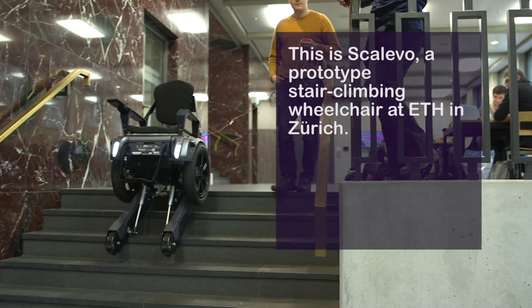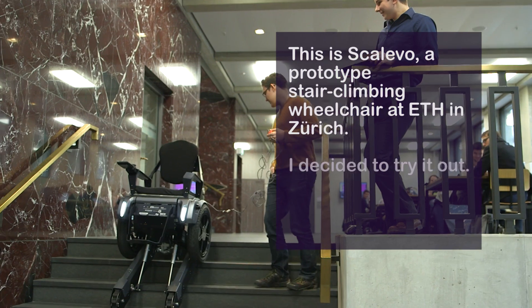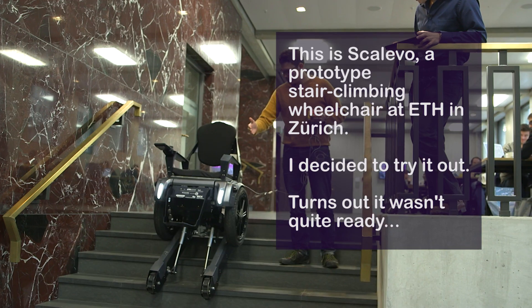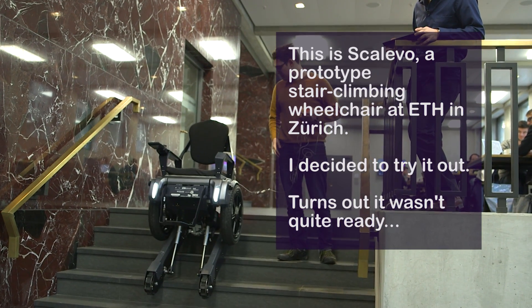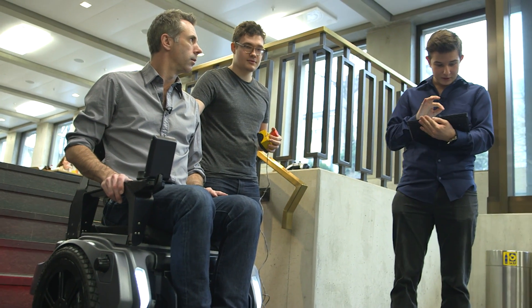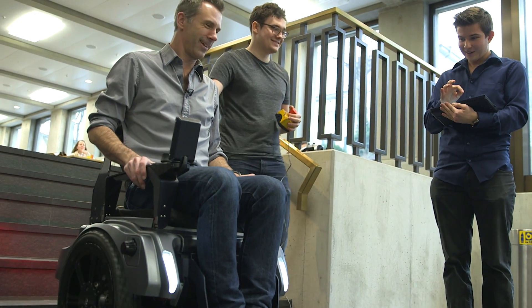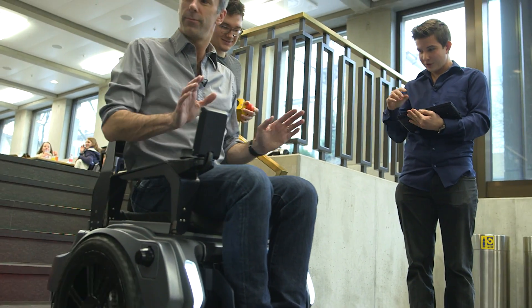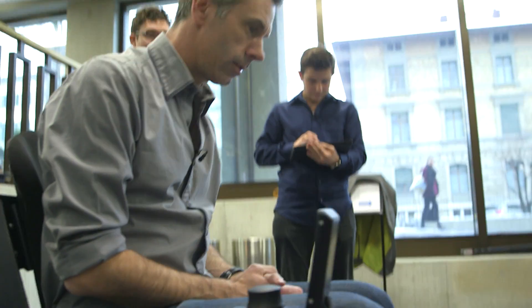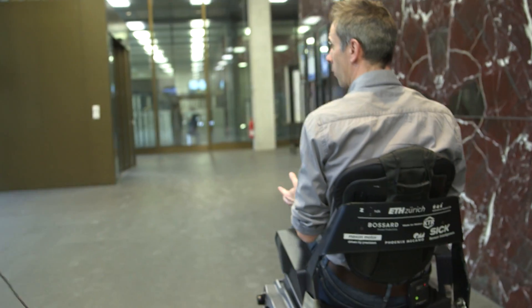So it goes way faster than this. You can actually lean back and forward to steer, and to accelerate and brake. But be very careful. So this is like riding a Segway? Yeah.